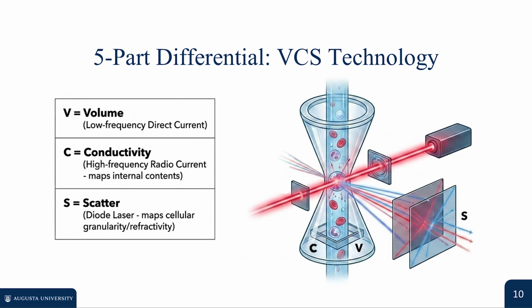High-throughput laboratory analyzers provide a comprehensive 5-part differential using VCS technology, analyzing leukocytes in their near-native states without harsh cytoplasmic stripping. VCS stands for volume, conductivity, and scatter, combining 3 distinct physical probes into a single measurement flow cell.